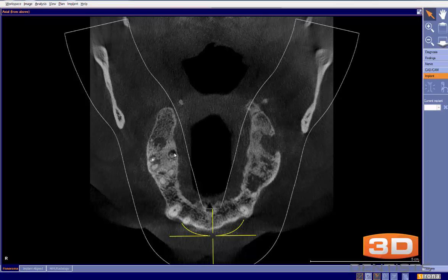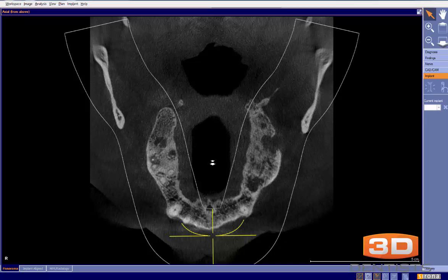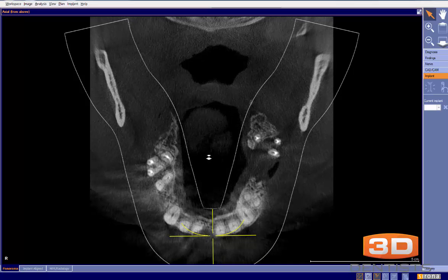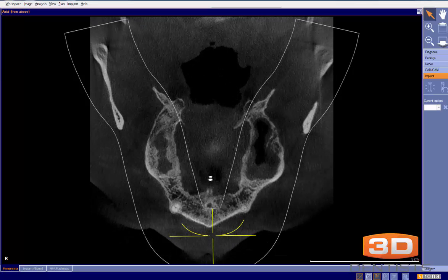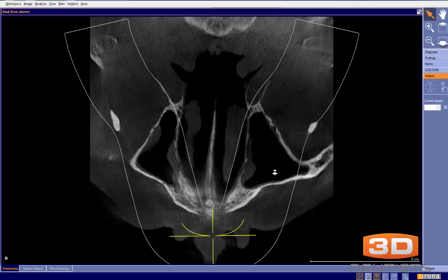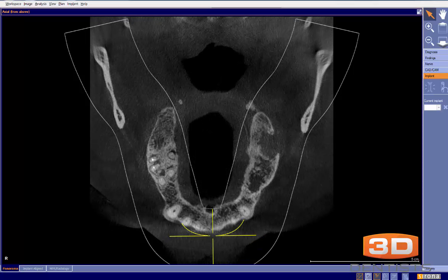As I'm going through, I also notice there's an infection — or residual infection — which works out to be tooth number three. We can also see quite a bit of infection on the upper left-hand side, which we know is associated with teeth. My question is: is this infection in the sinus associated with this particular tooth right here?